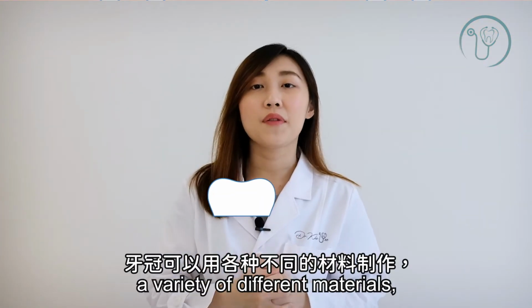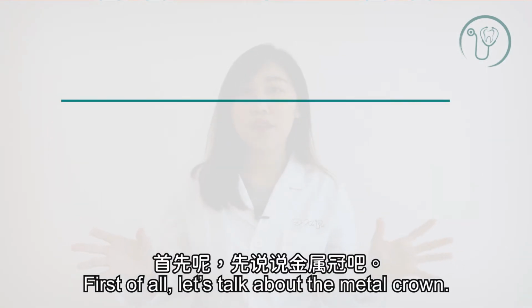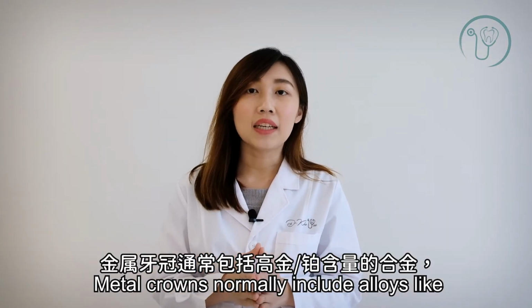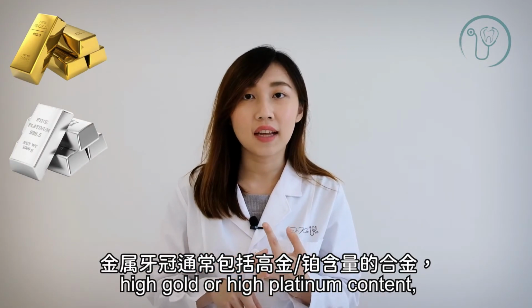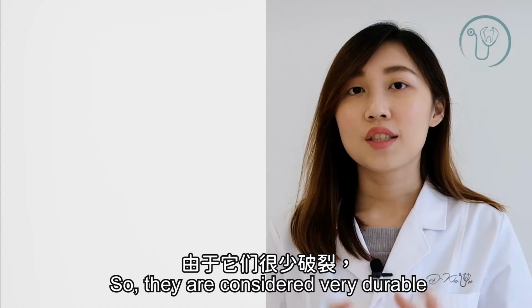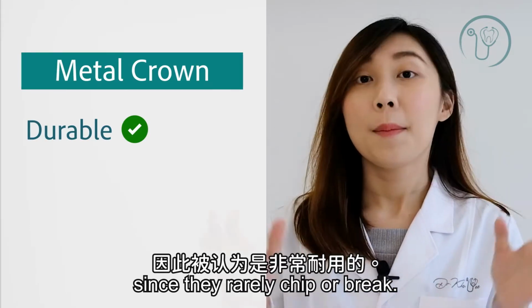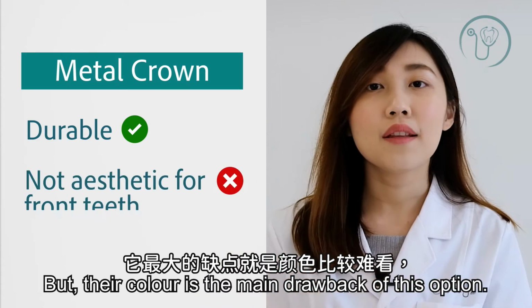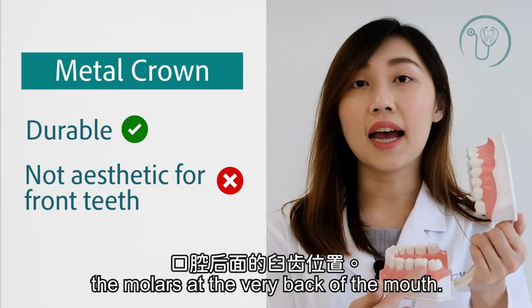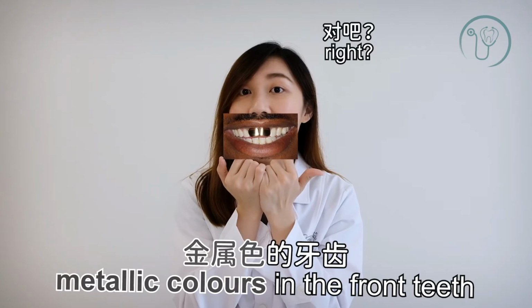The crowns can be made from a variety of different materials, but which one is the best for you? First of all, let's talk about the metal crown. Metal crowns normally include alloys like high gold or high platinum content, or base metal alloys including nickel chromium or cobalt chromium. They are considered very durable since they rarely chip or break. But their color is the main drawback of this option. That's why they are often used for the molars at the very back of the mouth, because no one wants to see the metal color in the front teeth, right?